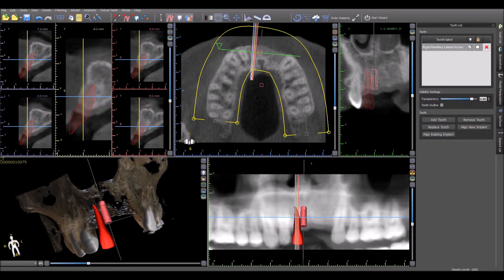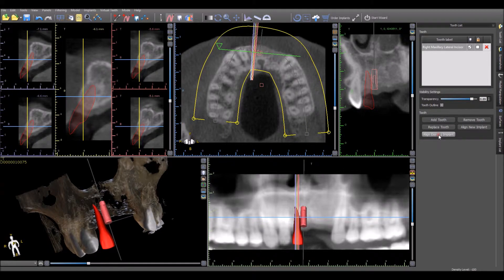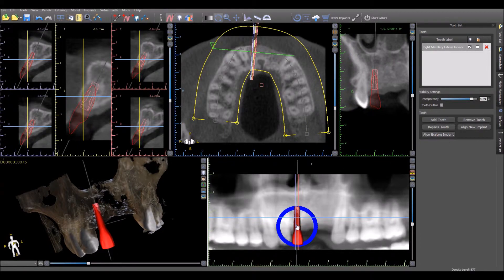If the virtual tooth exists in the treatment plan, as does the implant, and you would like to move the implant to support the virtual tooth automatically, click Align Existing Implant and then click on the implant itself. The implant will now be aligned automatically by the software to support the virtual tooth.